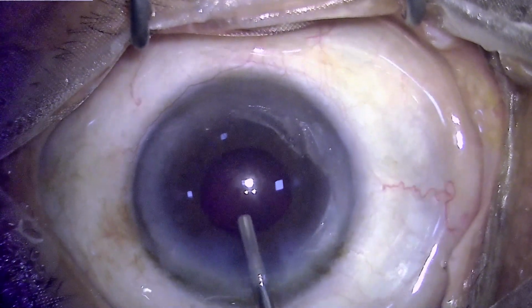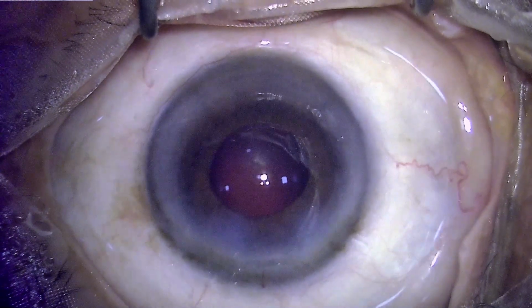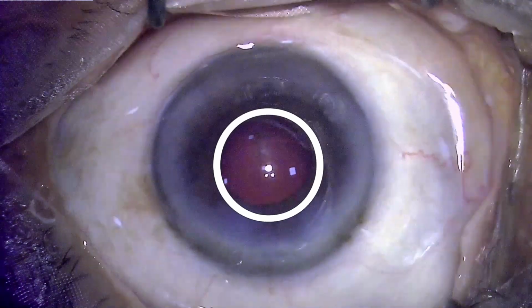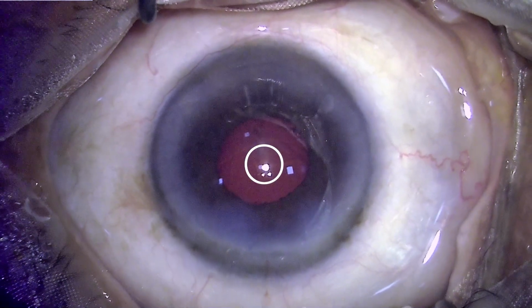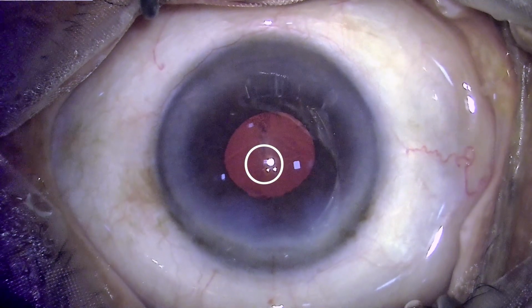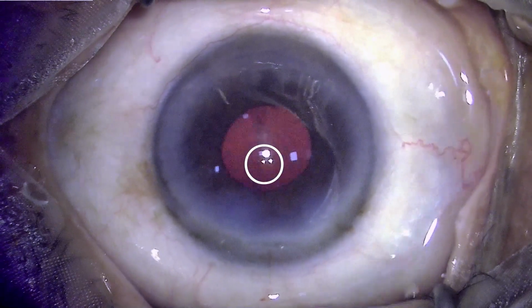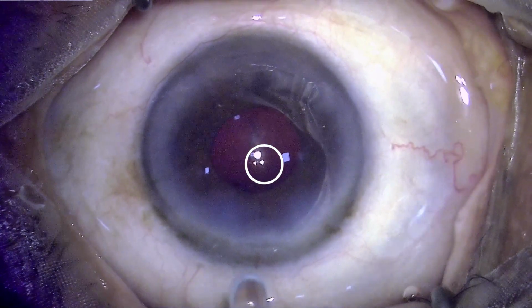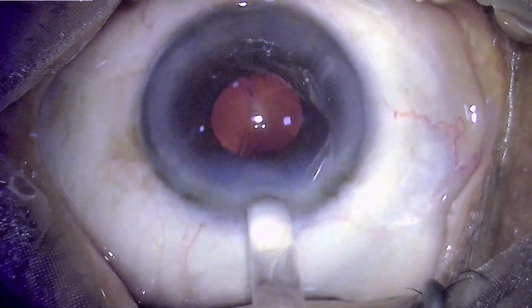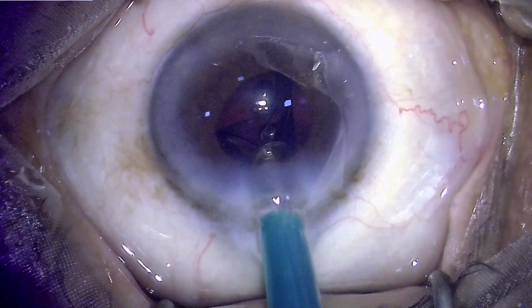At this moment we can see the pupil is not very big, but it is providing us a port through which we can implant the IOL. And here I would like to mention that we can see the reflex of the microscope. These are the three lights which are visible. Two are the coaxial illumination lights and one is the oblique one. Right now we can see only the reflection from the cornea. Once we implant the IOL, we'll see the reflection formed by the IOL also.